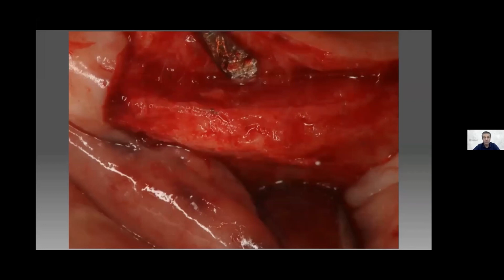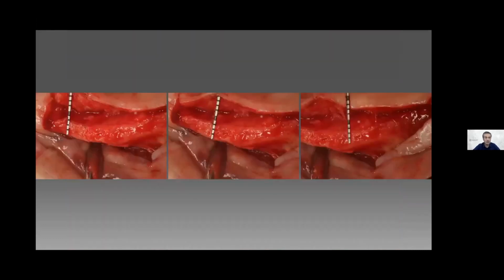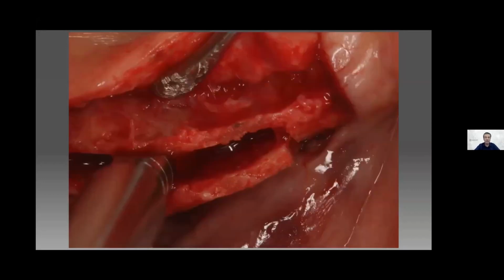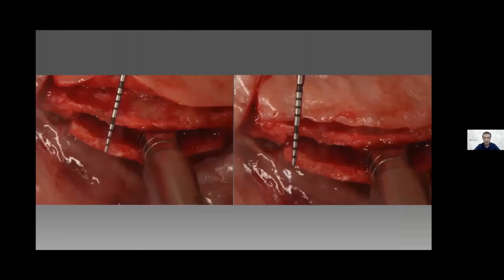This is the case during the surgery. Here, I want you to see that we have only 3 millimeters of bone in width. So we decided to use the same technique, the splitting technique. And we also did 2 vertical incisions here. It will be easier to infract the buccal bone from the palatal. And look how much we can enhance and augment the space when we are splitting with the chisel. Here we have 5 millimeters of thickness with the space.